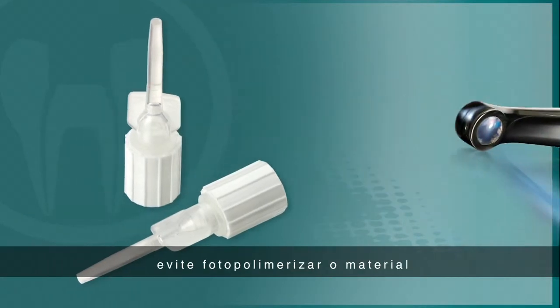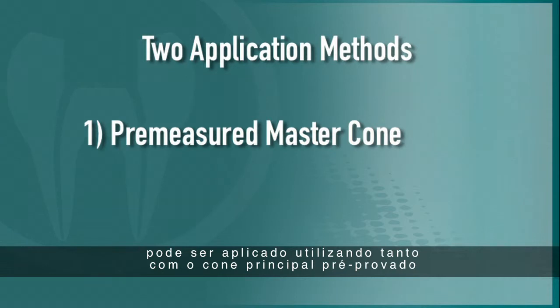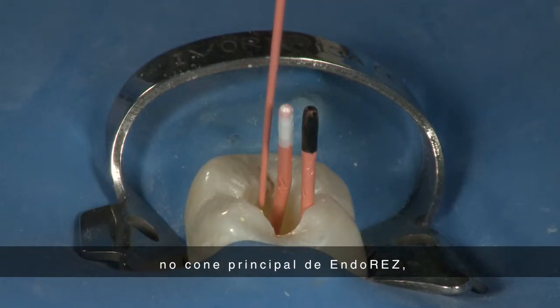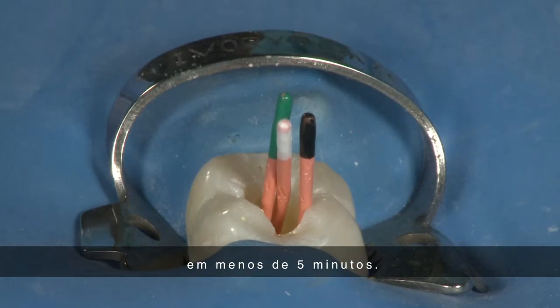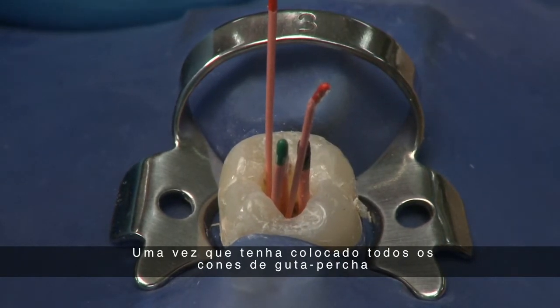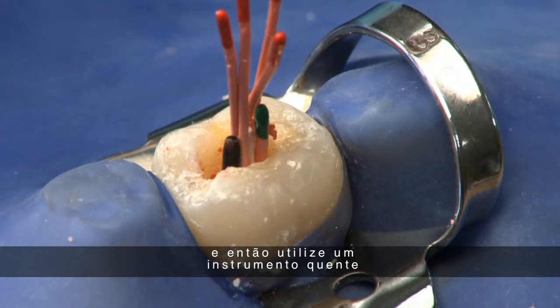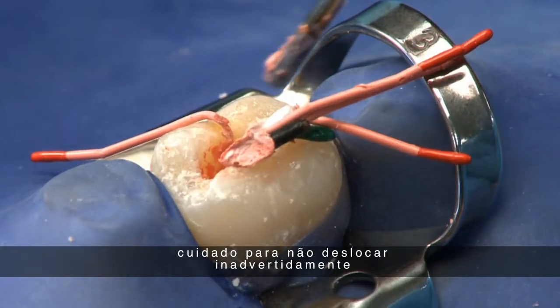EndoRes Accelerator is an ideal way to move directly from obturation to a post-placement procedure without scheduling a second appointment. When using EndoRes Accelerator, omit light curing and follow the subsequent steps. Accelerator can be applied using either a pre-measured master cone or accessory points. Using cotton forceps, place an EndoRes gutta percha point into the chemical. If you use Accelerator on the master EndoRes point, move quickly for radiographic confirmation, as the Accelerator will cause EndoRes to polymerize in less than 5 minutes. When using accessory points, use a minimum of 2-3 points to assure a rapid and complete set. After 5 minutes, test the set of the sealer, then use a heated instrument or searing device to trim the excess gutta percha, taking care not to inadvertently dislodge the cones from the canal.